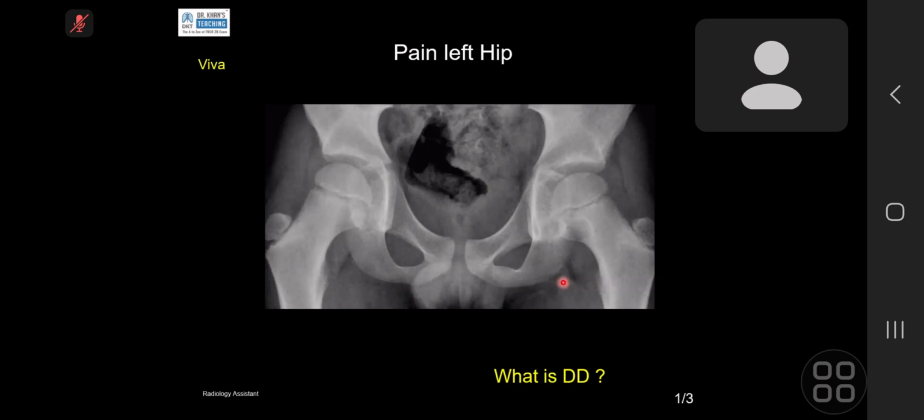Although I would normally expect it in the tibial metaphysis region, this is possible. There's endosteal scalloping of the cortical margins, so potentially a bone cyst, and another differential, but not very likely, is an aneurysmal bone cyst. But there's no multiloculated appearance or septa within. So I would go with non-ossifying fibroma.